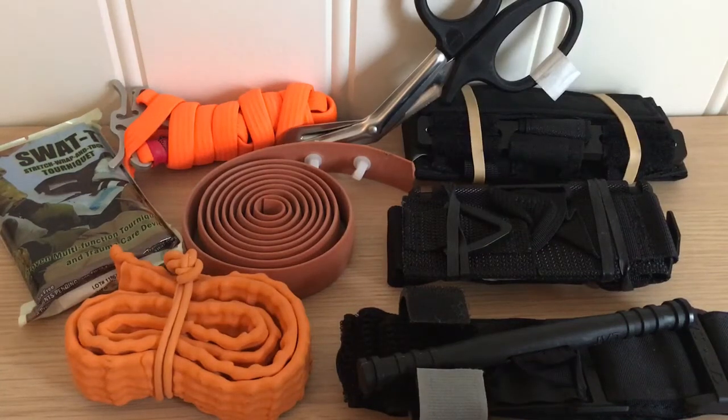Hello and welcome back everyone. Today I thought I would talk about tourniquets and tell you some things which most people on YouTube who show you tourniquets don't talk about. So firstly, placement. Placement in the military, as we have heard many times, is high and tight.